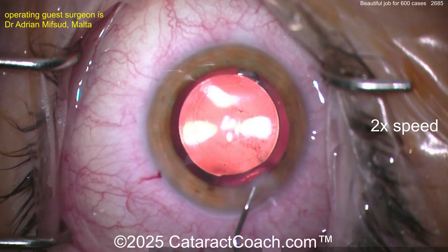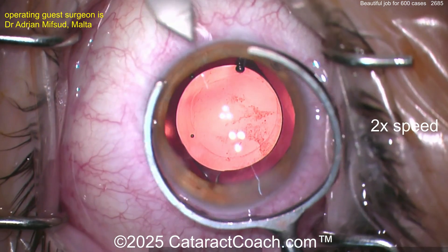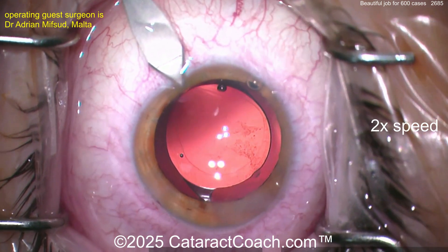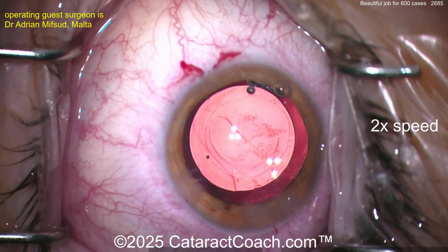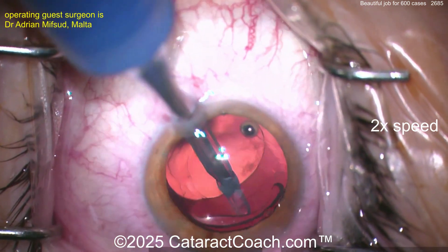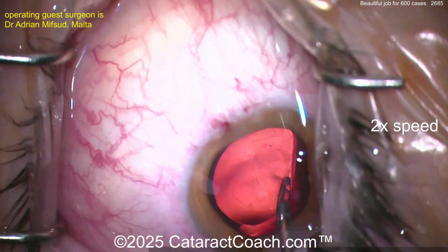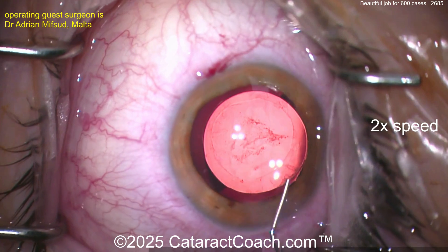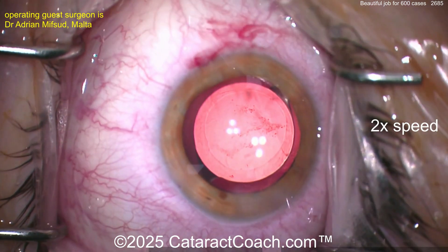Let's seal up the incisions and call this done. Again, this is fantastic for case 600. Now, why would you do a second incision? Well, obviously for treatment of astigmatism — notice how the second incision is opposite the main incision. Using that keratome, that's going to give you a good amount of flattening at that meridian — about 0.75 diopters. Why do this instead of a toric lens? Sometimes the patient can't afford a toric lens and you want to help them anyway. The paired incision for reduction of astigmatism has been described for 30 years or longer in ophthalmology — it's not a new technique. With these standard paired incisions, you can get about 0.75, maybe even a diopter against the rule, maybe a little bit less with the rule. Your main incision and the second incision are both on that same steep axis of the cornea.